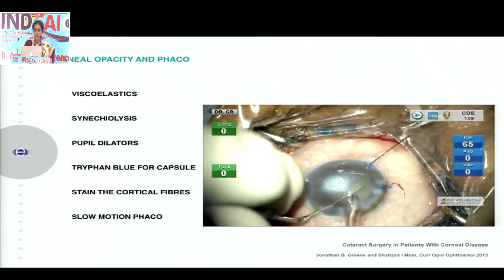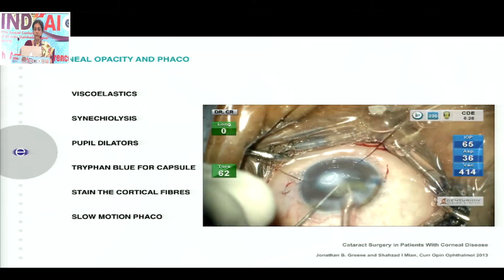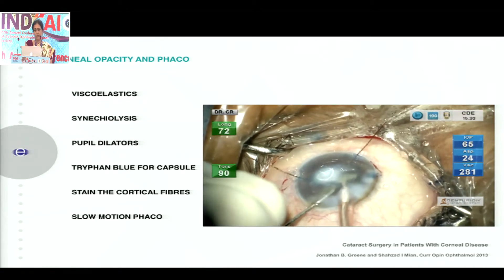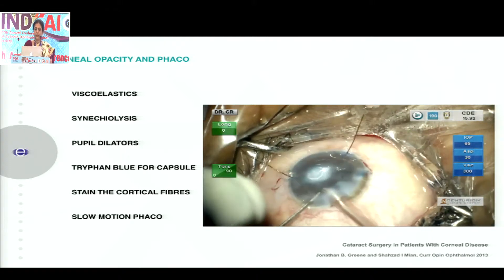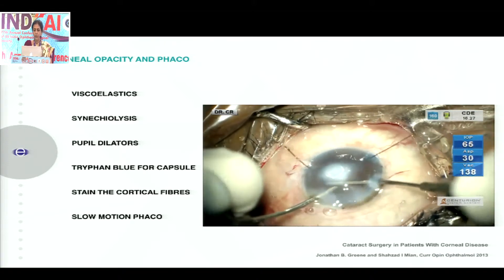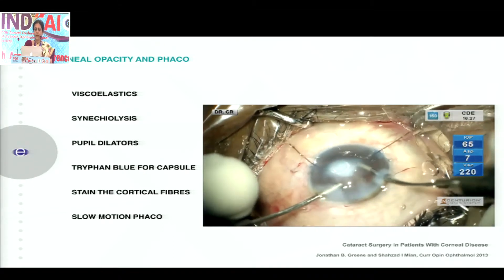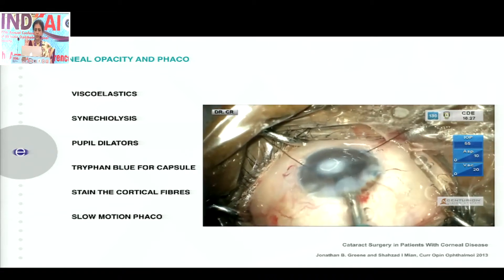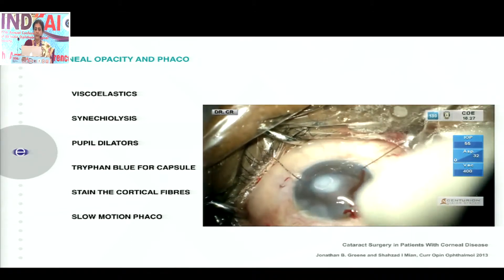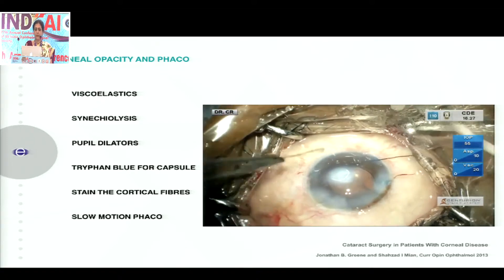You are able to get away with it. Start your phacoemulsification slowly — slow-motion phaco — and try to do it in the visual area. Do a stop and chop, which may be the easiest way of dealing with this. When cortex removal becomes a bit of a challenge, go just along the pupillary margin, just below, where you already know the cortex is going to lie. You are able to remove most of the cortex. Sometimes a gentle hydro will loosen recalcitrant cortex. After placing an IOL, visibility often becomes better, allowing you to visualize those sheets of cortex and remove them.